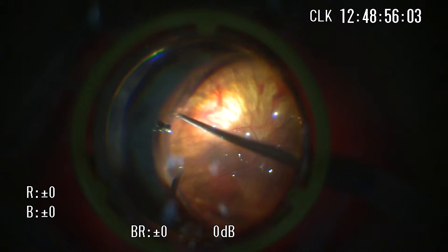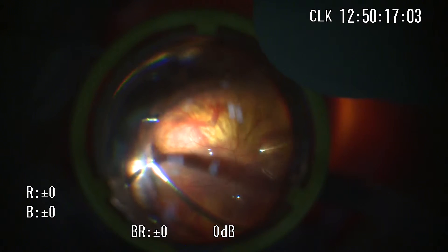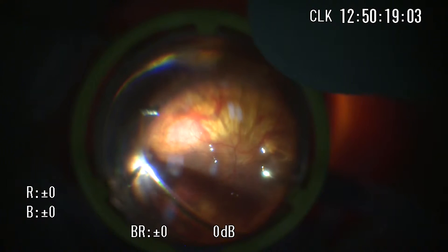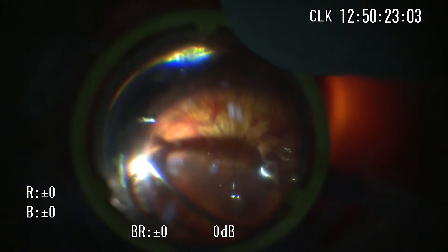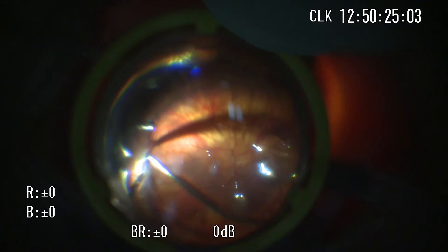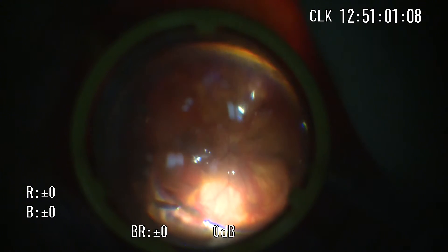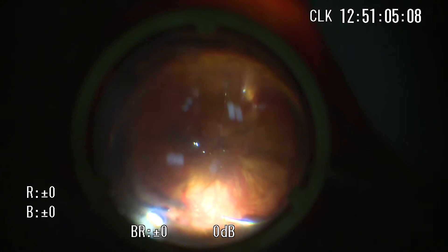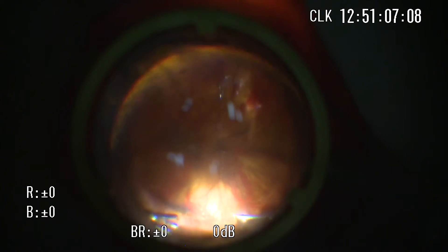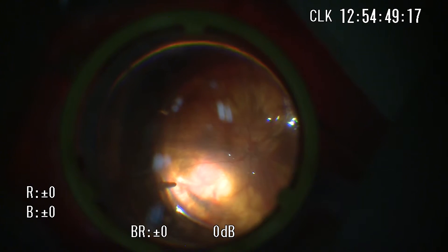For complete peripheral vitrectomy, scleral indentation is required during vitrectomy under fluid infusion. Indentation can be performed by an assistant, meaning a second hand for the surgery, and perfect cooperation of two surgeons is required to avoid retinal touch. Or if the surgeon wants to perform scleral indentation by himself, chandelier illumination is required, which means more scleral incisions.